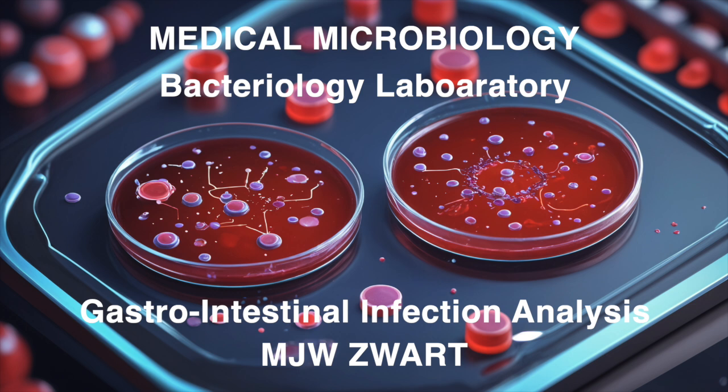I think I'm ready. All right, first question. What's the biggest advantage of using PCR for gastrointestinal infections? Well, I'd say it's speed. You know, PCR lets us find those common bacterial pathogens really quickly right from the sample.